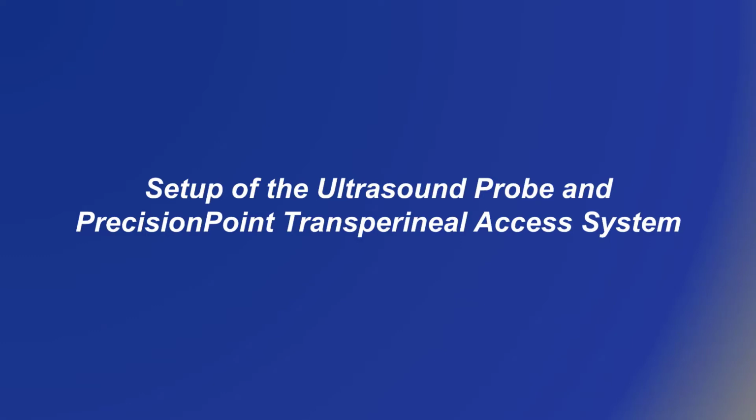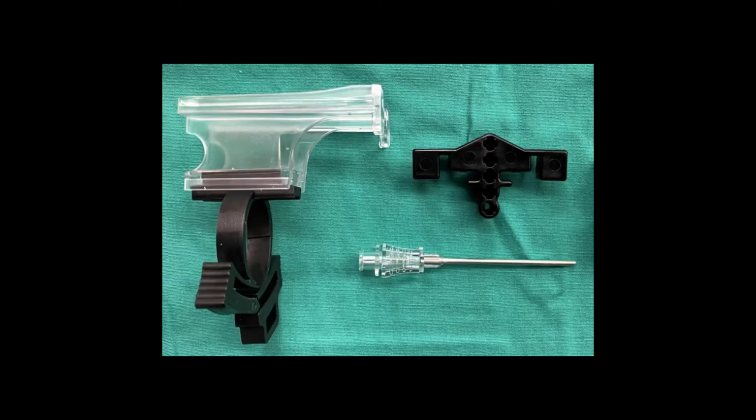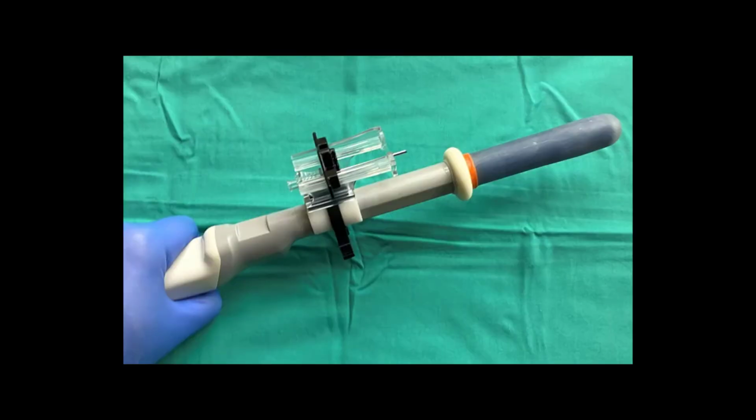Setup of the ultrasound probe and Precision Point Transperineal Access System. The Precision Point Transperineal Access System is a sterile single-use disposable needle guide comprised of three components: a rail, clamp subassembly, a needle carriage with 5 aperture holes, and a 15-gauge access trocar. Prior to use, the device is assembled by the user and attached to the ultrasound probe.